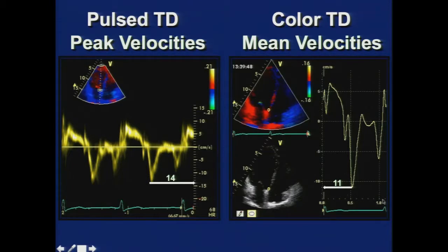And this may be important when looking at amplitude parameters, say, for example, using the E over E prime ratio when we talk about diastolic function in this course. You can imagine it's going to be very different whether you use pulse wave or color tissue Doppler. And in the diastolic function guidelines, for example, they're talking about pulse wave Doppler. So remember, pulse wave gives you peak velocities, color gives you mean velocities. The velocities will be higher in pulse wave than they will with a color Doppler. Whether we're talking about blood pool Doppler or Doppler of the myocardium, it's the same principle.